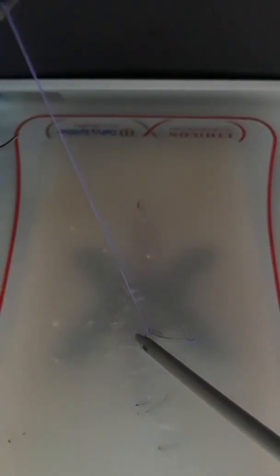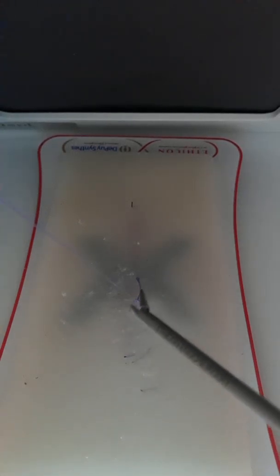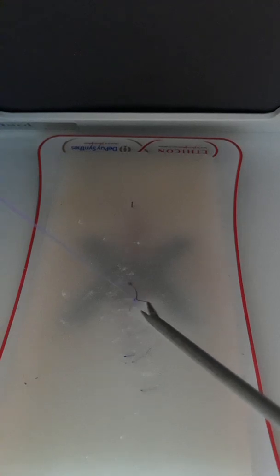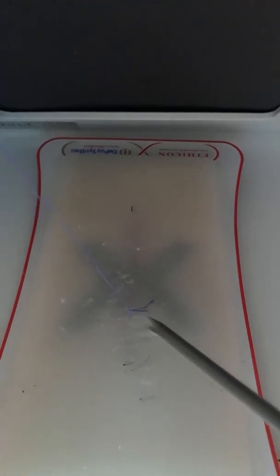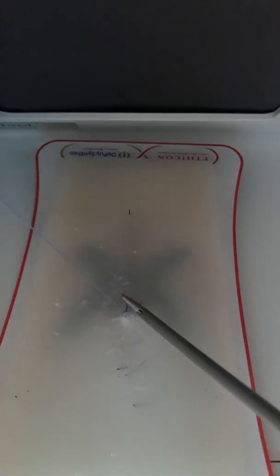If my Samsung phone cooperates—there we go. You pull on the left side of the suture, which helps you cinch the stitch. I've done this with Mohammed several times and it's worked every time, but it's giving me a hard time right now.